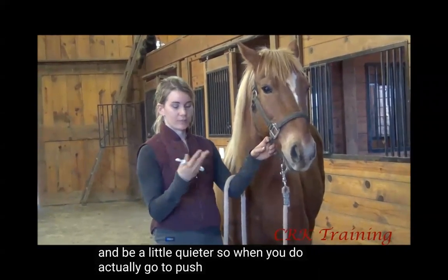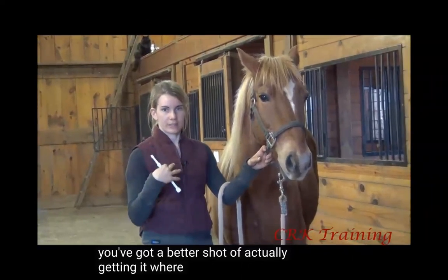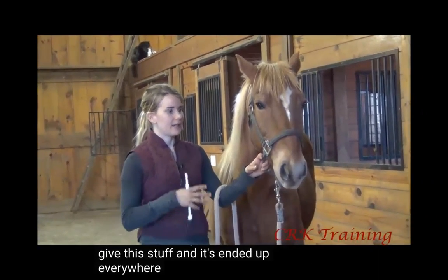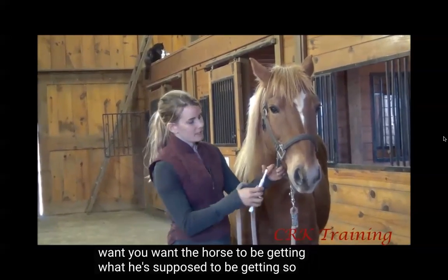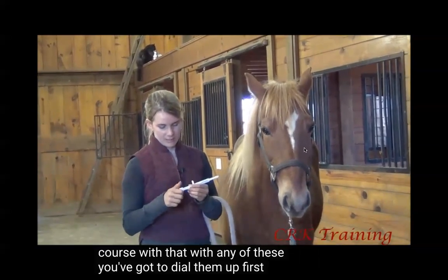So when you do actually go to push the medication in, you've got a better shot of actually getting it where it needs to be, because we've all tried to give this stuff and it's ended up everywhere else, which is a waste of your money, and you want the horse to be getting what he's supposed to be getting. So of course with any of these, you've got to dial them up first.